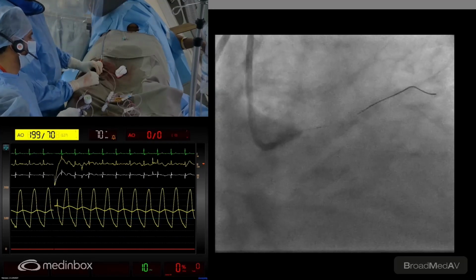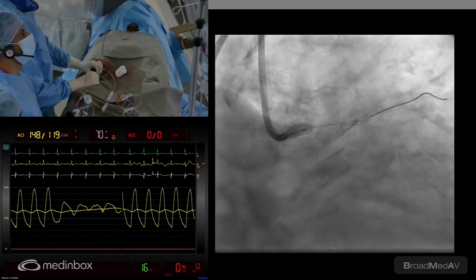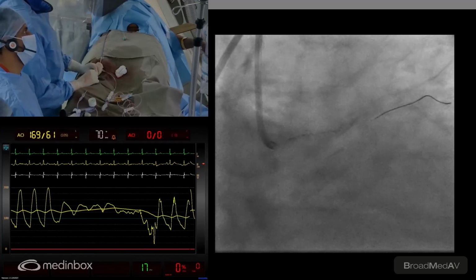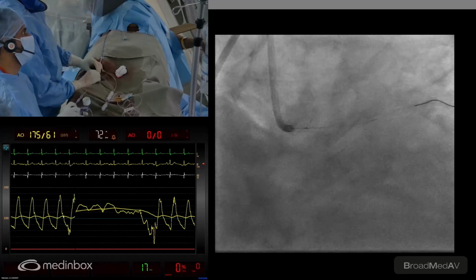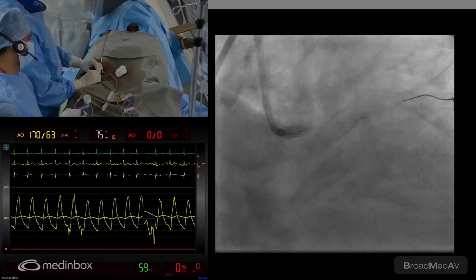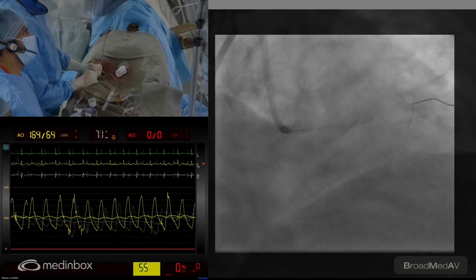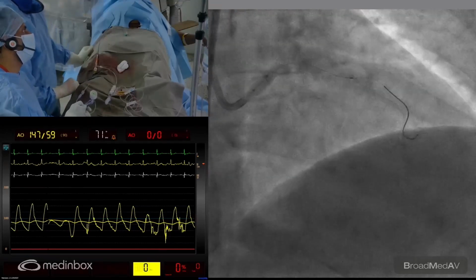So going up with your 5 millimeter balloon, just go to 6, nominal, 7, please. 8, 9, 10, 12. So that's a 5. Deflate. Go up here, please. 5, 12. And we flare it now. Go up, please.